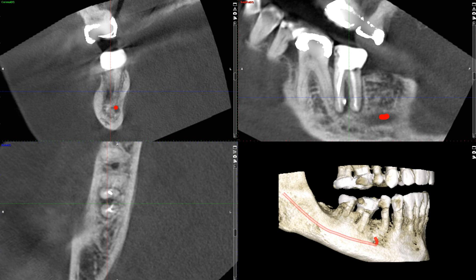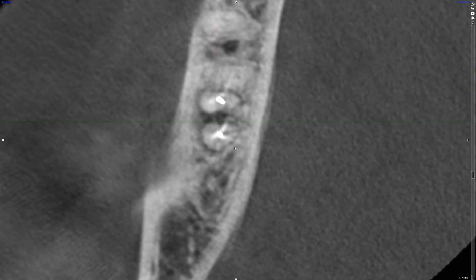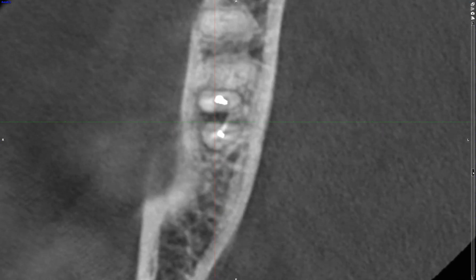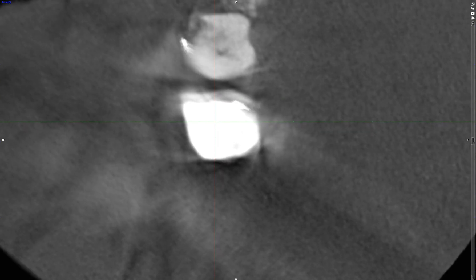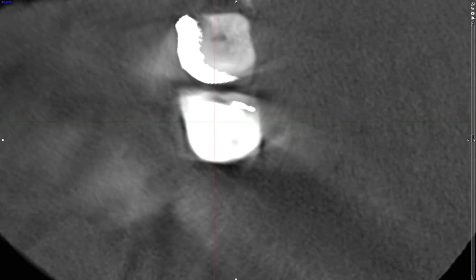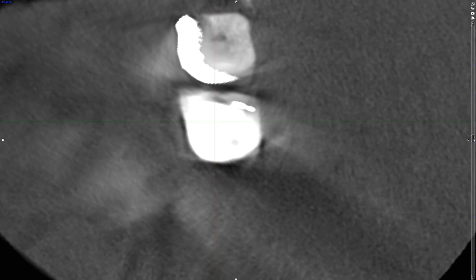Typically I like to assess just about any volume in the axial view first. In this case perhaps you'd appreciate the visualization in the sagittal view as you may be more familiar with this particular orientation. But for the time being let's go ahead and take a look at the axial view, starting from the coronal portion of the crown and moving down toward the apex.